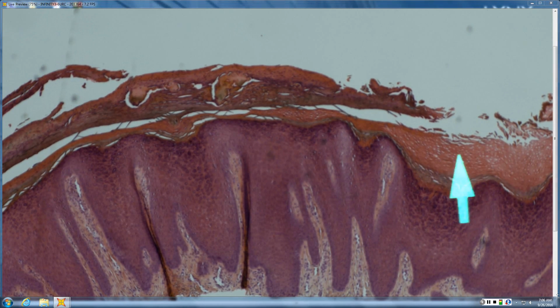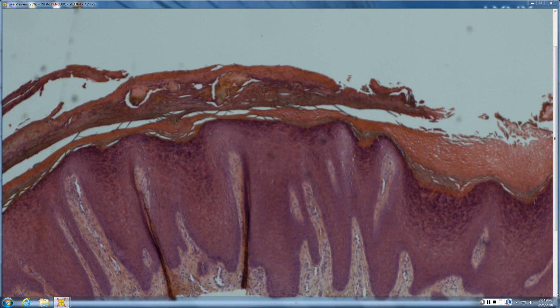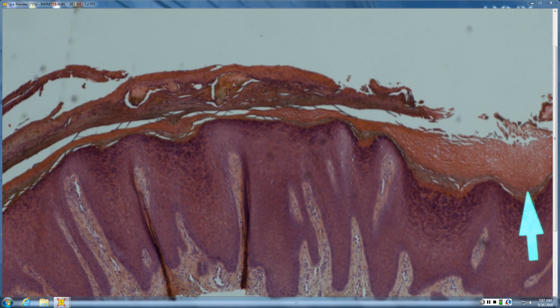There's no confluent parakeratosis. There's no neutrophils. Now that's sort of ignoring this little section here. This little section here is from excoriation and from scratching and picking and all that type of stuff. So you have to kind of ignore that and say that generally speaking, the whole thing is orthokeratosis. There's even this pseudostratum lucidum, where it starts to look like acral skin.